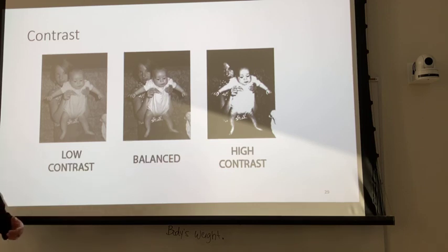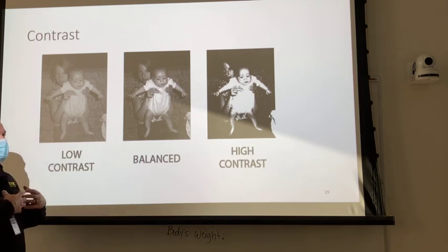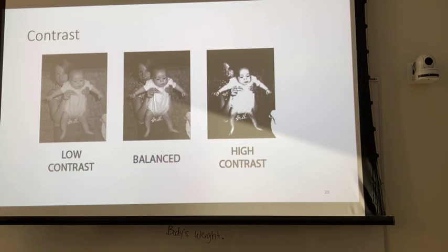So it's pleasing to the eye to see a high contrast X-ray image, but we don't want to see high contrast on everything. If we see high contrast on a chest X-ray, then what we've essentially got is an area of apparent high patient density in the ribs, right?